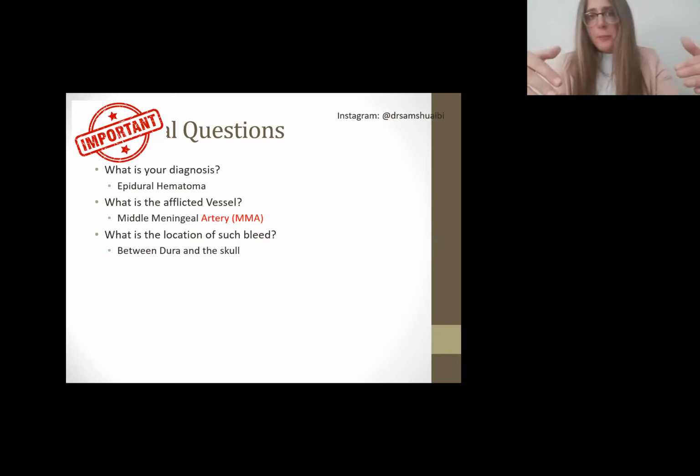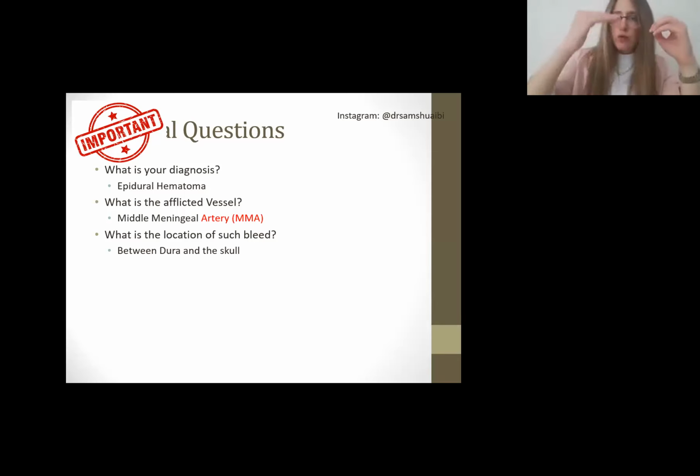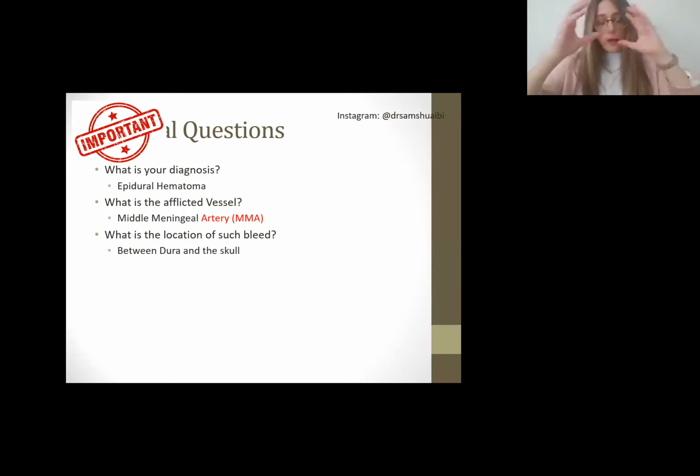A lot of the causes of epidural hemorrhages are from trauma, RTA, fighting, all of that. I have seen a lot of this. The third question: what is the location of such a bleed? They will put dura-skull, dura-arachnoid, arachnoid-pia, so they will confuse you. I just want you to know, epi means on top. It's between the skull and the dura, the outermost layer of the meninges. So it's the outermost of the options. Always remember that. These are super high yield.